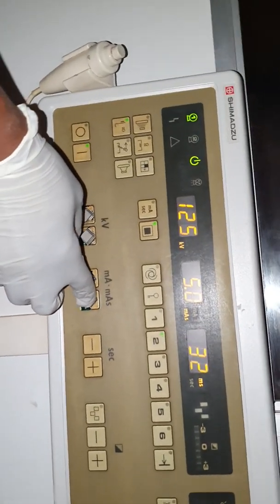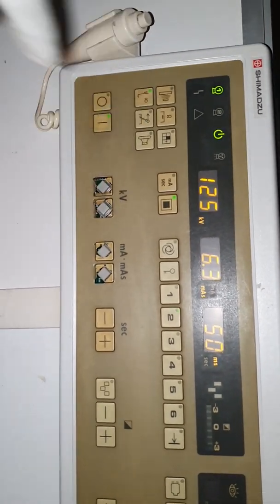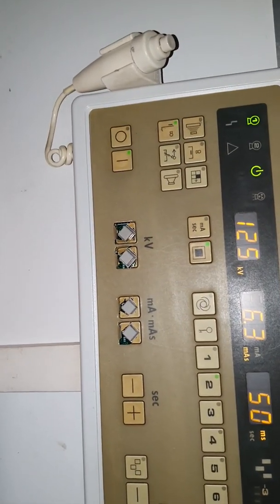Pre-select your exposure factors for your lateral projection. You will increase your MAS and your KVP will remain constant. You will take a 35x43 imaging receptor and place the imaging receptor portrait.